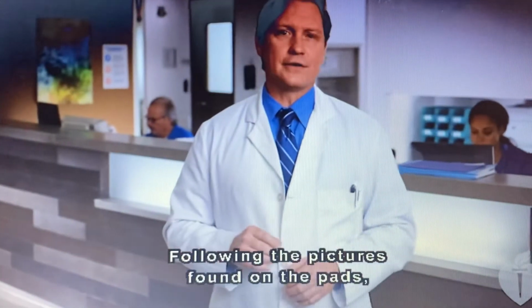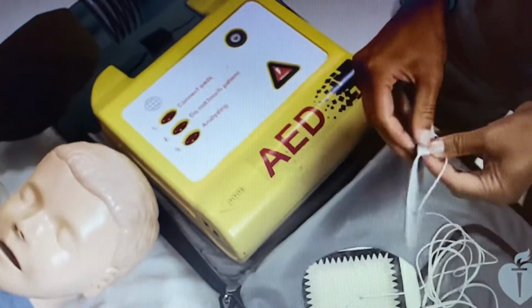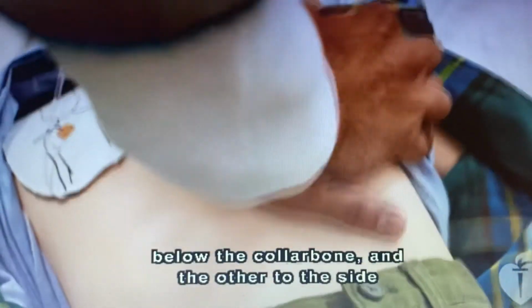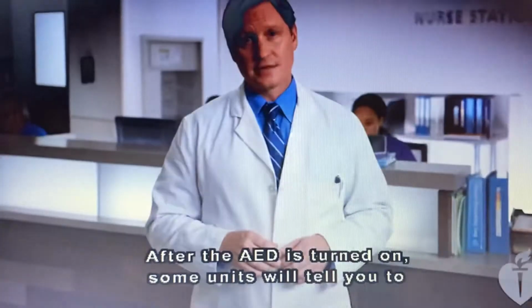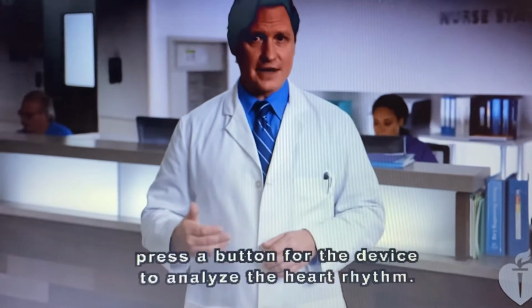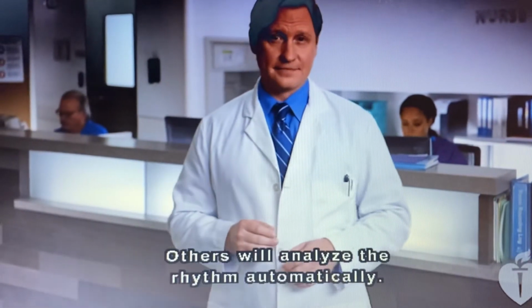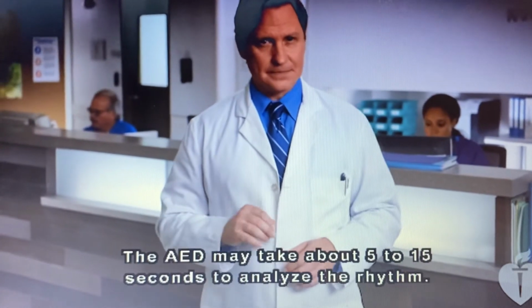Following the pictures found on the pads, attach the adhesive pads to the victim's bare chest. Place one pad on the child's upper right chest directly below the collarbone, and the other to the side of the left nipple. Plug in pads. After the AED is turned on, some units will tell you to press a button for the device to analyze the heart rhythm. Others will analyze the rhythm automatically. The AED may take about 5 to 15 seconds to analyze the rhythm.